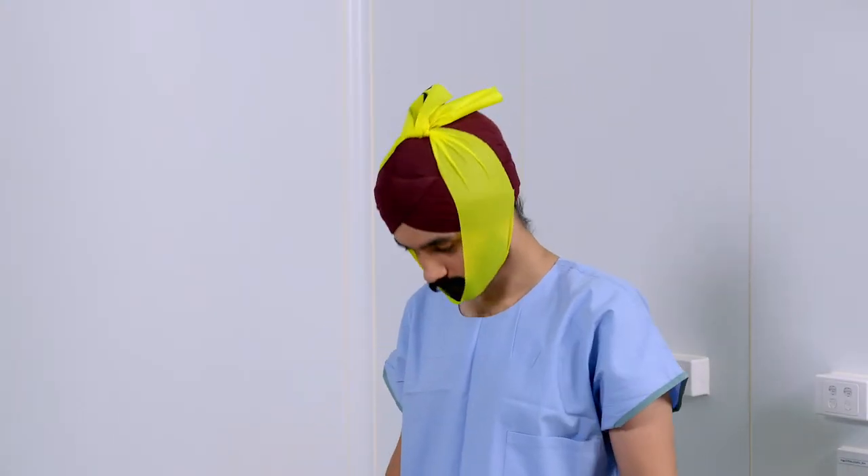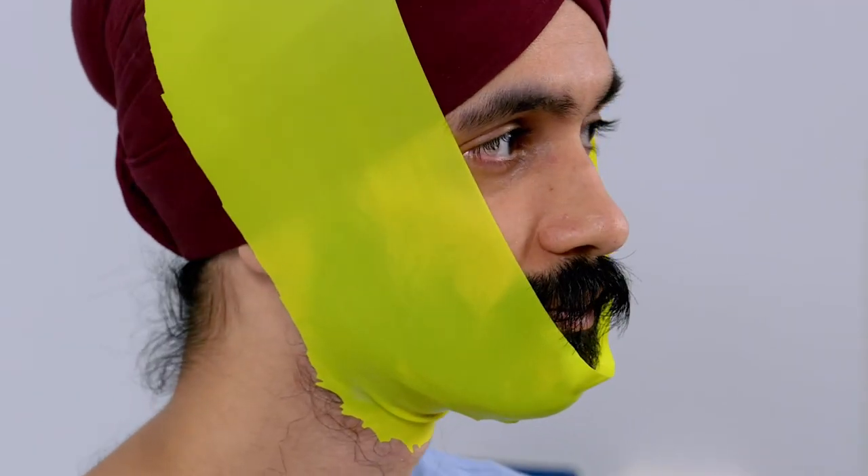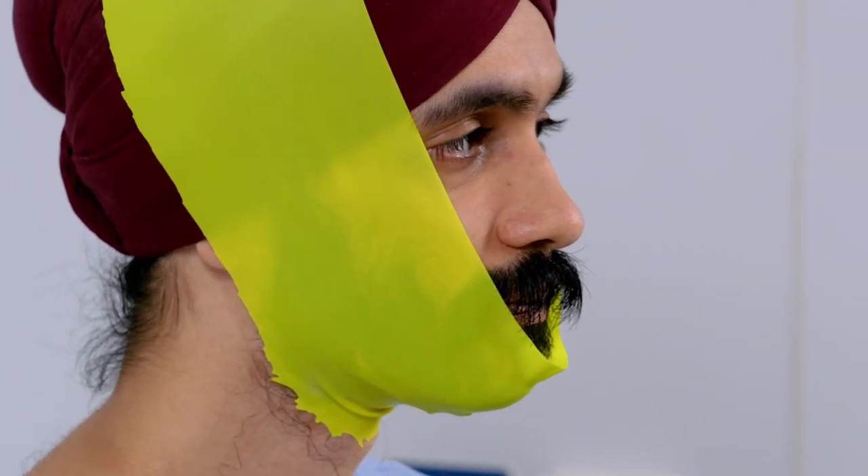Move your head back and forth, then up and down to make sure the band will not come undone, cause discomfort or move with head movement.